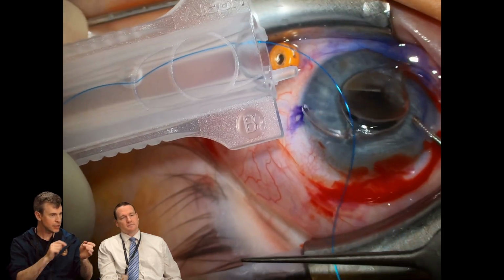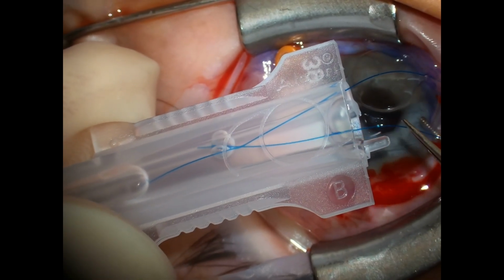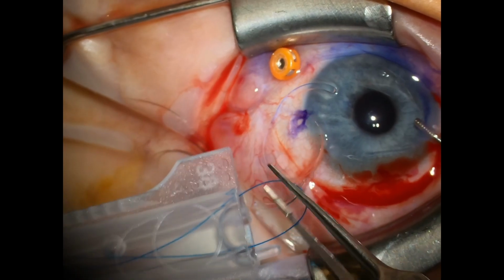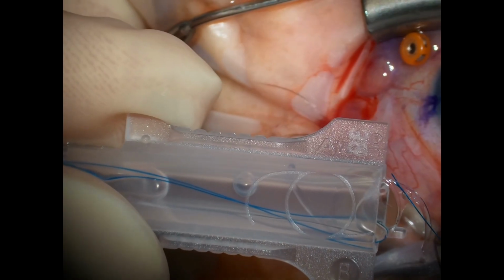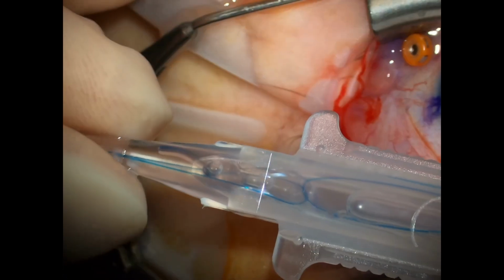Here, the leading sutures are placed in a B cartridge, which is the cartridge where usually an IOL is implanted. A larger intraocular lens. This is a one-piece. Traditionally, one piece shouldn't be placed in the sulcus. This, again, is far back. We'll show later where exactly it's placed, so lower risk of interacting with the iris.